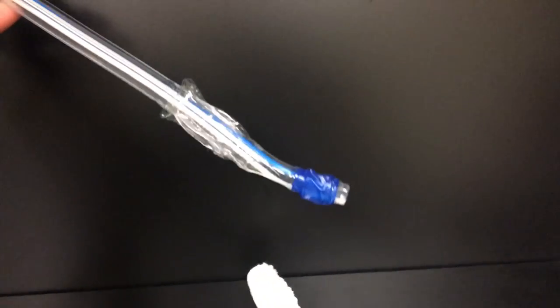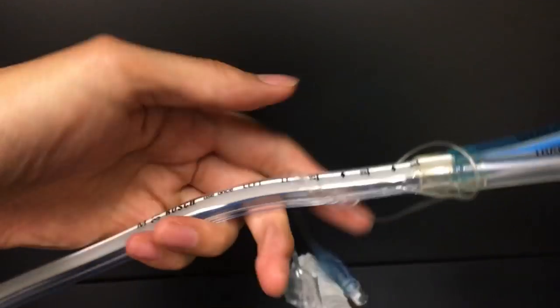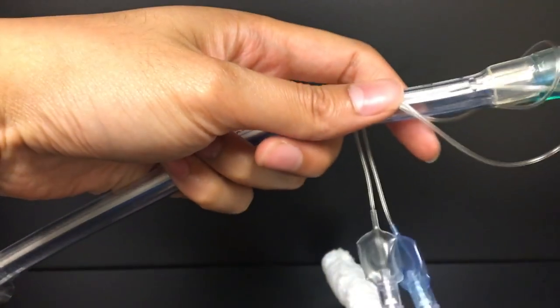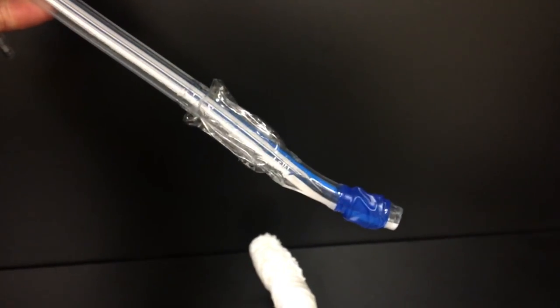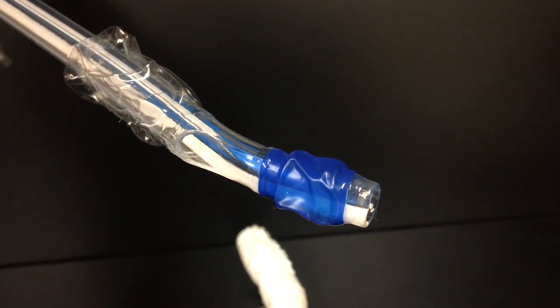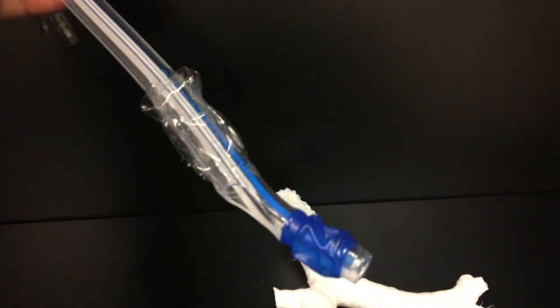This is it. It's the one we have in the lab. It's just a 37 French. I think it's a left. Is it a left? Yeah, it's left. But this is it. This is the one that we've tested all the other airways with. Ideally, you'd want to add a little bit of lubrication to this end so that it goes in a little bit easier, but I think this will just work out for today. Let's see if I can show this off, because I've already done it. It works.